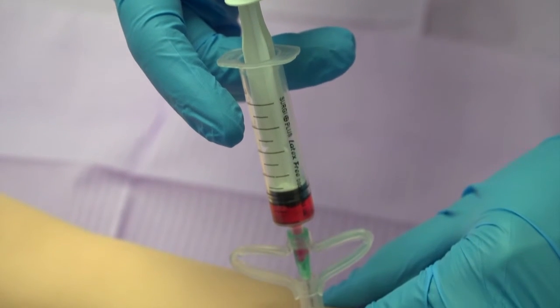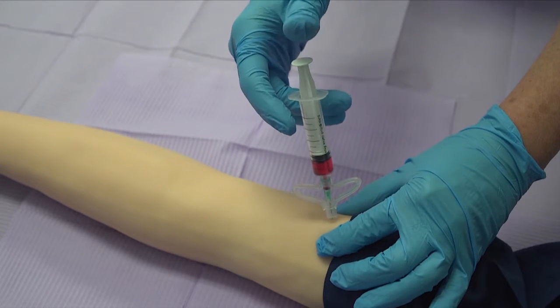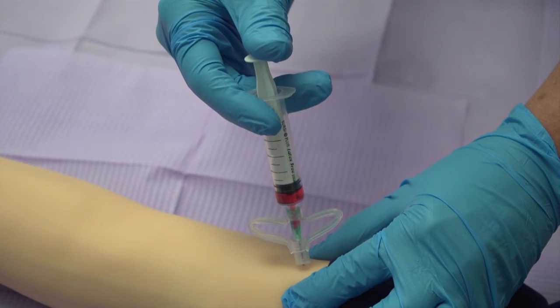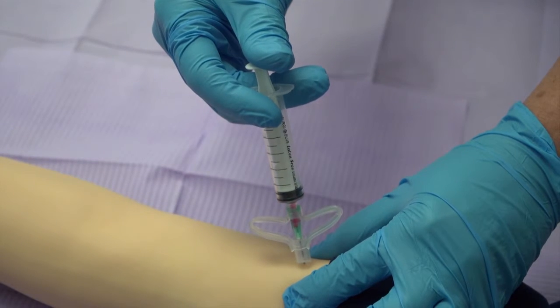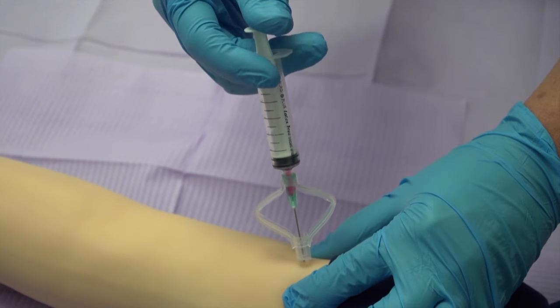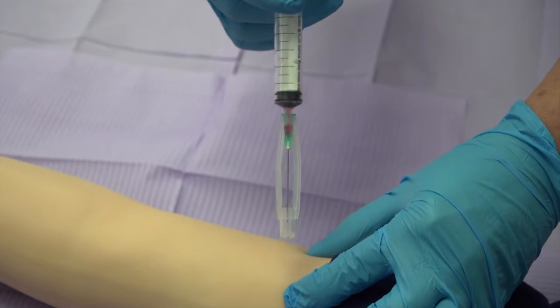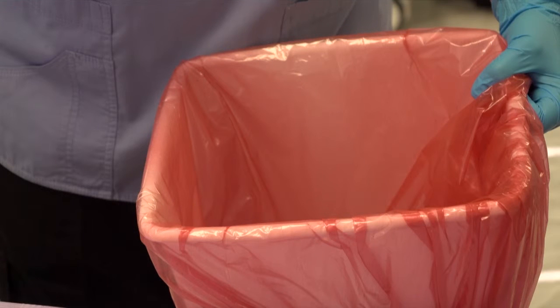It is of utmost importance that the clinician releases his or her finger hold from the silicone wing before injecting, so as to make the safety feature available during and after the injection procedure. Use the hand previously holding the silicone sleeve to perform the injection. Withdraw the needle. Check if the needle's passive safety feature deployed correctly and that the needle is therefore in the safe position with the end cap covering the needle tip. Discard the used needle plus syringe as a unit into an approved sharps waste container. Discard the empty syringe package and needle's straw-like cover in an approved medical waste receiver.